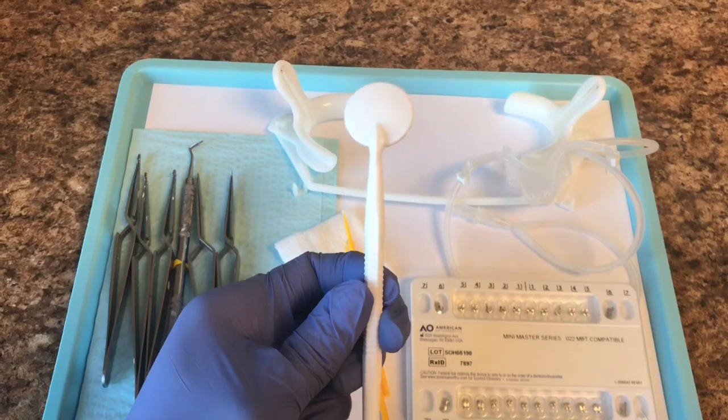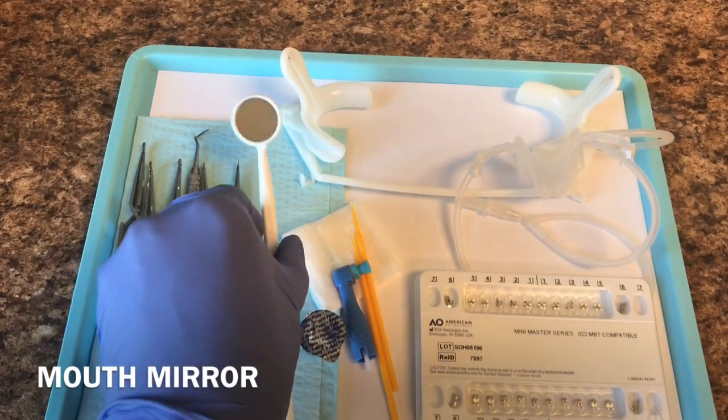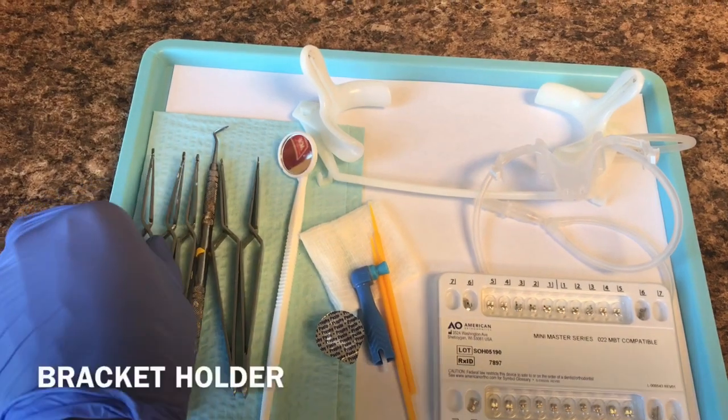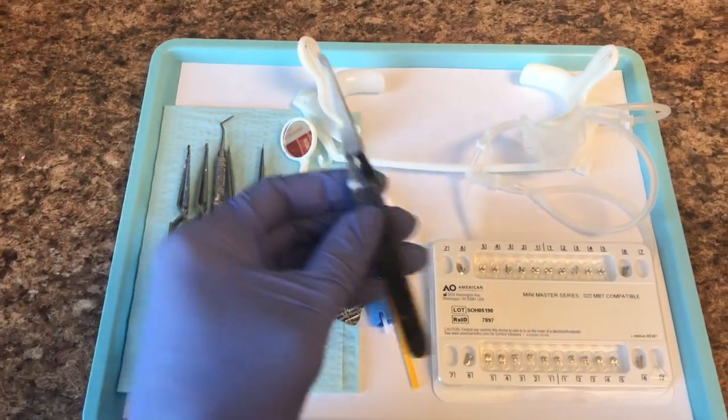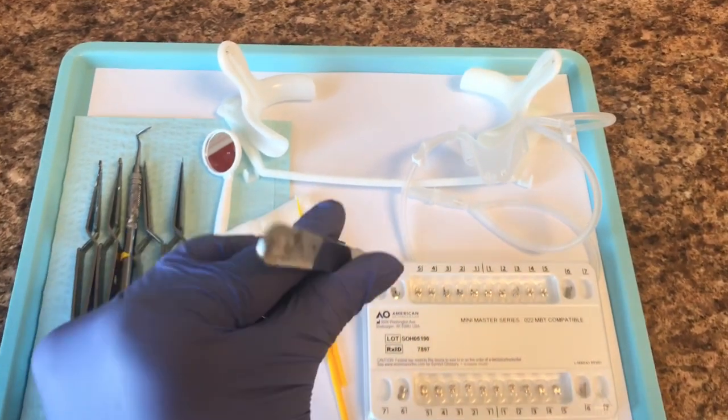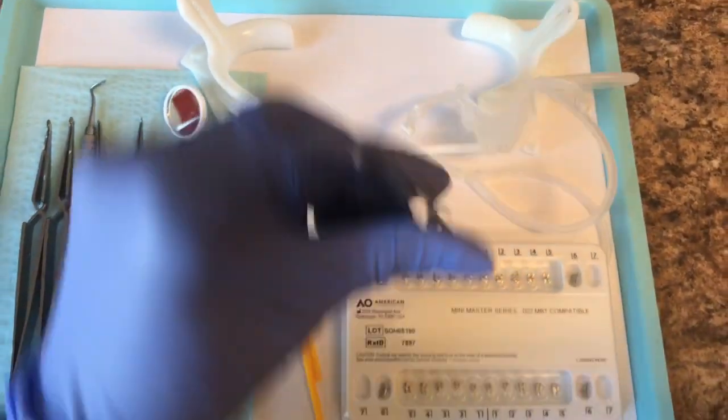We have your mouth mirror here. Next, we have your bracket holders. This bracket holder is used to pick up the bracket. They open and close just like this, and you'll basically just open it to pick up one bracket.